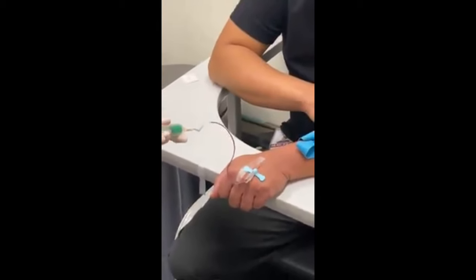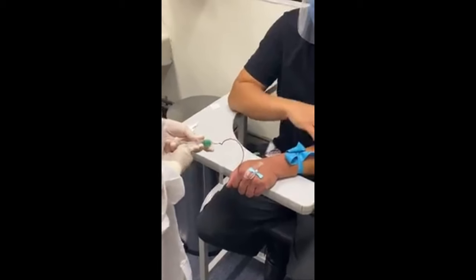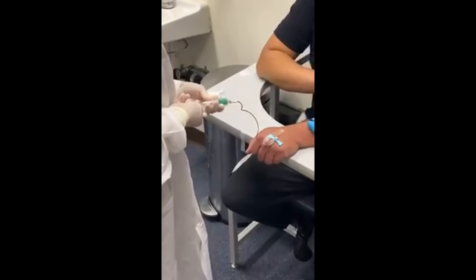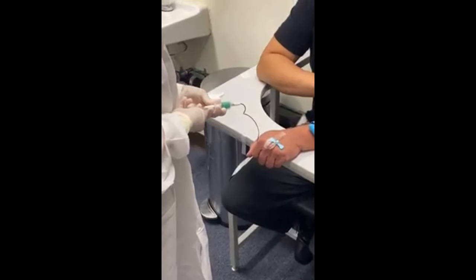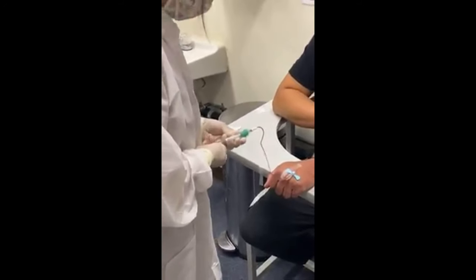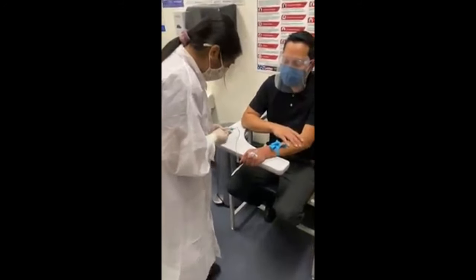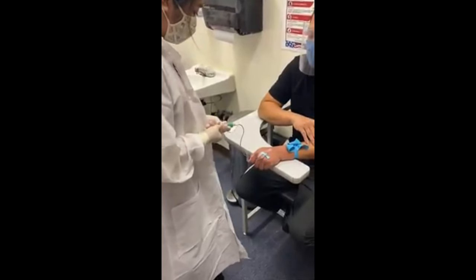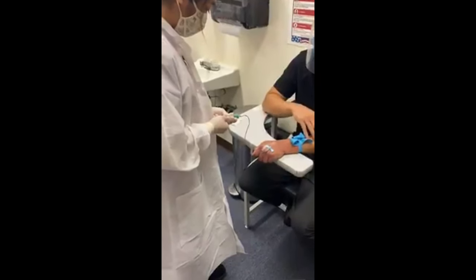That is so cool. Yeah, just the vacuum. But it's fine. You got it. That's actually a difficult thing. That was really a tiny one. That's a good job. How come it's going inside? Oh, just because of the vacuum. It's an expired tube, so... Yeah, you hit the vein because it was going in. Yeah, I can take it off.